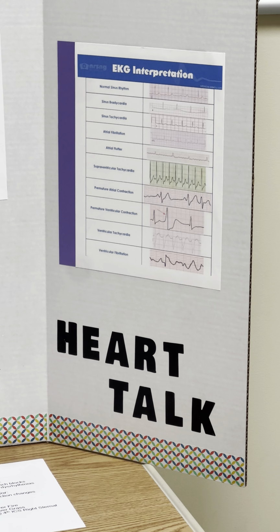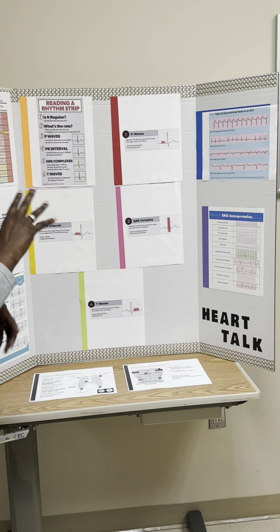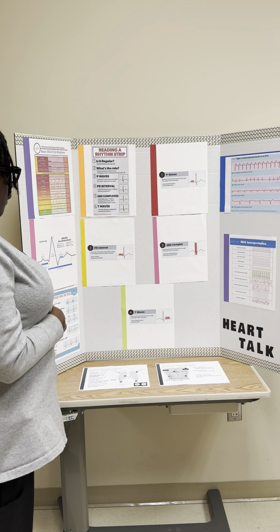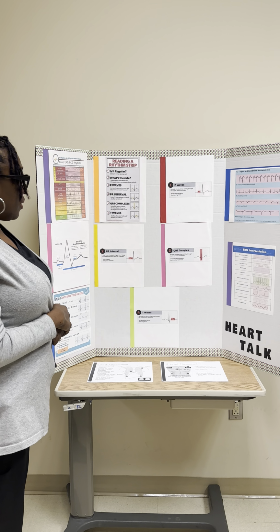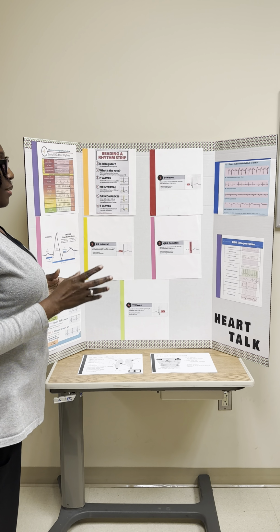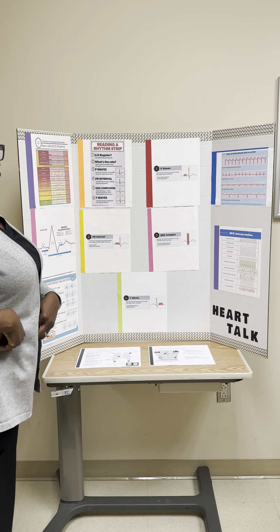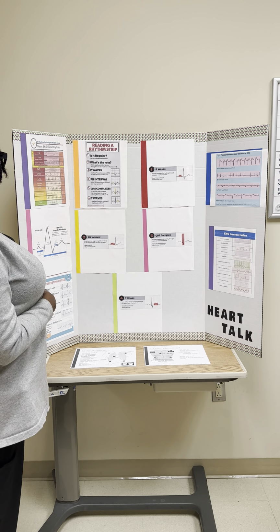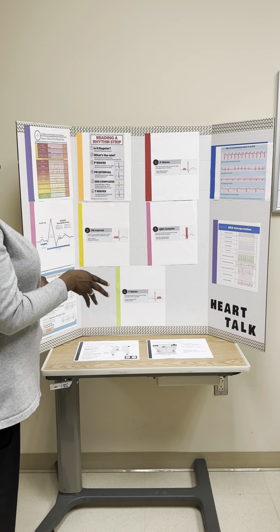You might have some occasional PACs and PVCs in your patient. It's not always going to require an intervention, you just have to know your patient. The takeaway is to always assess your patient. We're not assessing that monitor. No matter what it's saying, sometimes we'll get an irregular rhythm, you go in and the monitor's not even on the patient. It's on a gown, or underwear or whatever. So know your patients. And the bottom line, you don't have to know all these rhythms.